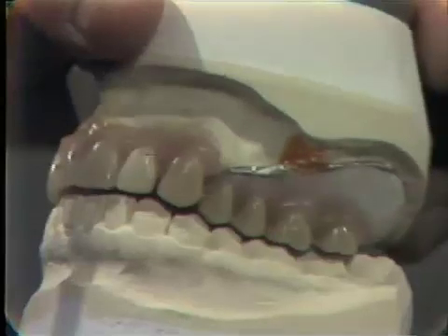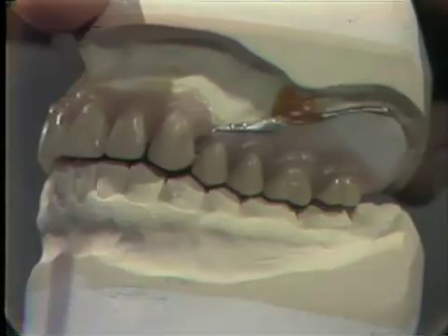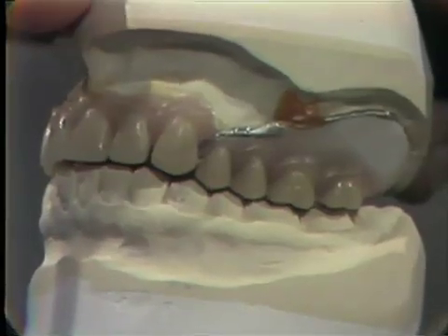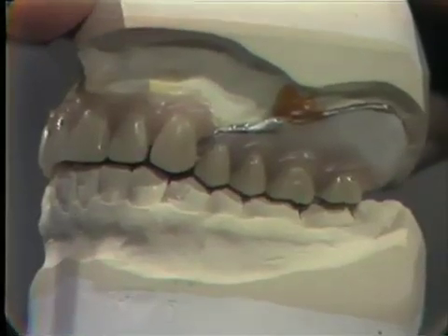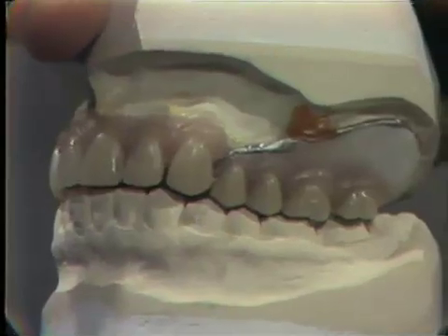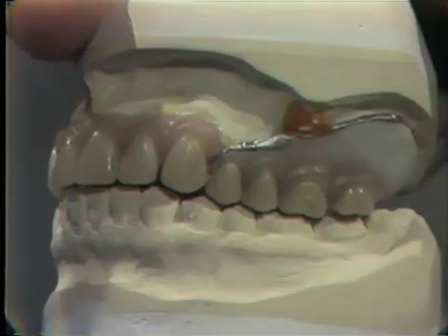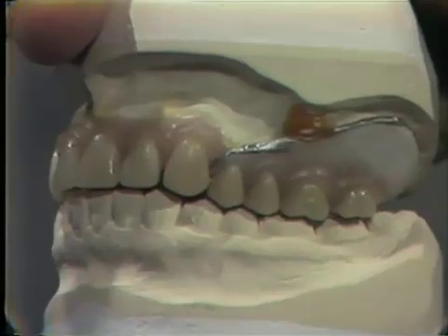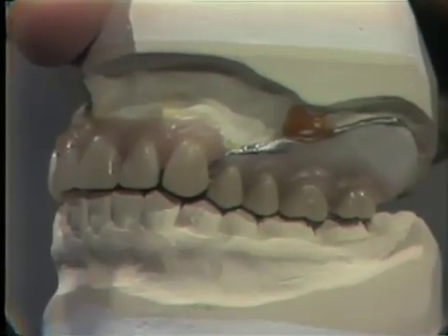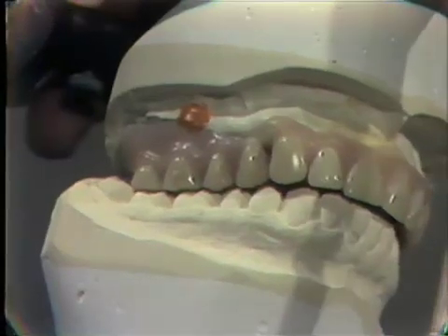The posterior baseplate with the teeth set and slightly waxed can be used for a posterior try-in if required or desired. If desired, this baseplate can be taken off the master cast, cleaned of wax, and placed in the patient's mouth — usually requiring a small amount of adhesive powder to keep it in place — and then the posterior occlusion can be checked with the patient. If a try-in is not necessary or desired, this arrangement can be waxed and sent to the laboratory for processing.